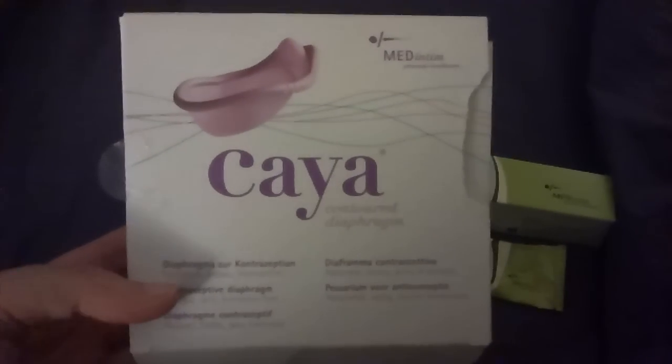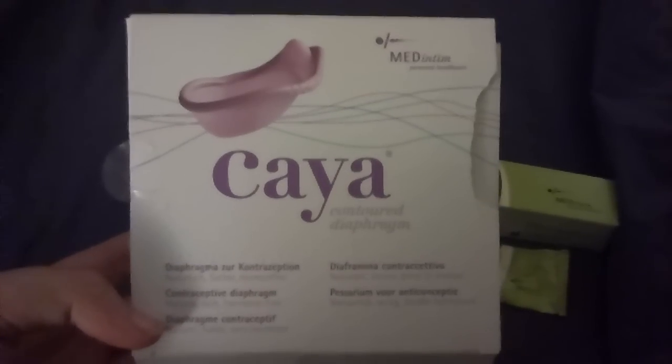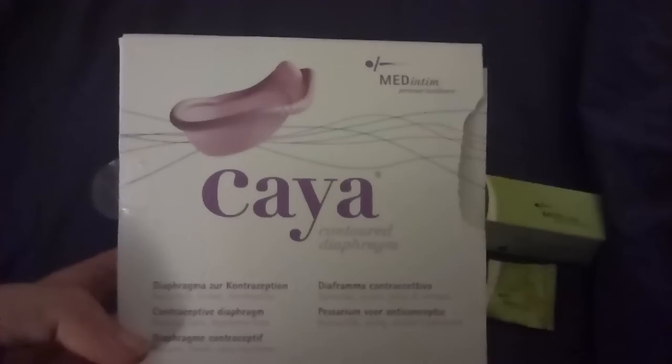It's Bex from PMT, and this is a video on the Caya contoured diaphragm. This is a one-size-fits-most silicone diaphragm, as opposed to traditional diaphragms which are sized and made out of latex.